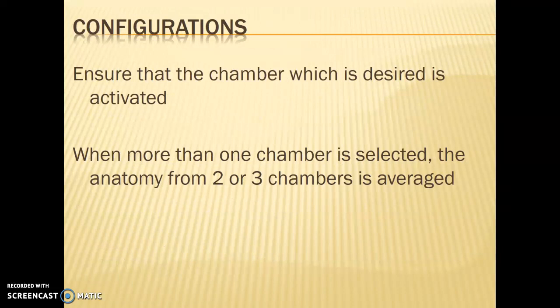It is important to ensure that the chamber that you would like to use is activated. When more than one chamber is selected, the anatomy from two or three chambers is averaged together.